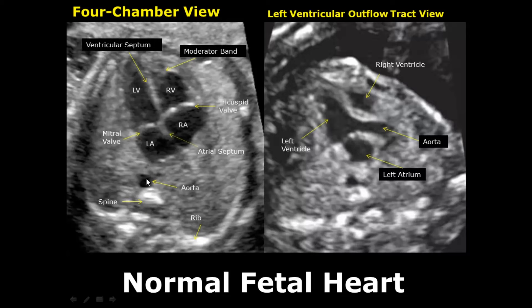When we locate the aorta, the nearest chamber will be the left atrium. In the left ventricular outflow tract view, we see a proper appearance of the left ventricle and the aorta. Here is the right ventricle, the posterior-most left atrium, and part of the descending aorta is also seen.